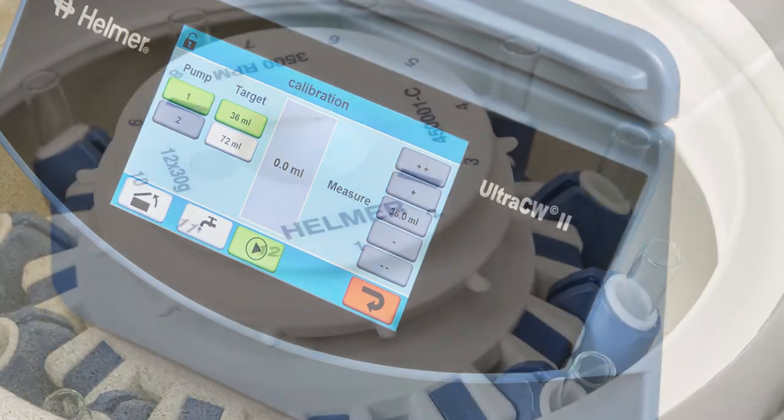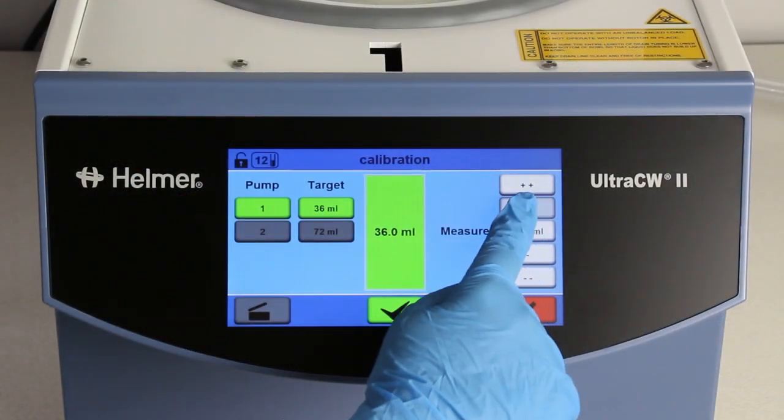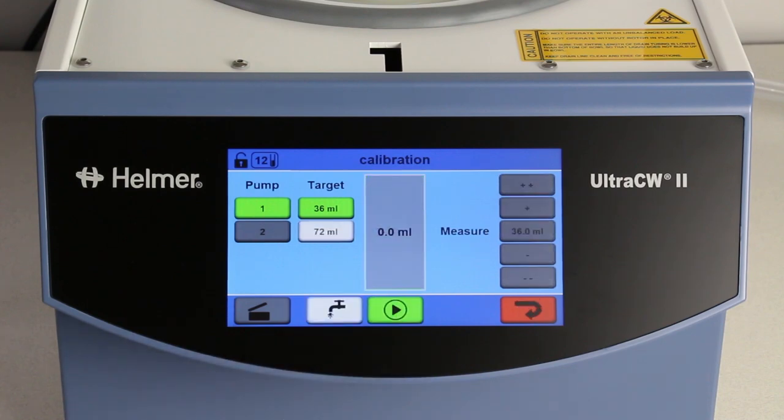The UltraCW2 offers the ability to conveniently adjust settings such as rotor type. In addition, digital calibration offers easy and accurate control of saline volumes and eliminates time-consuming, cumbersome manual calibration.